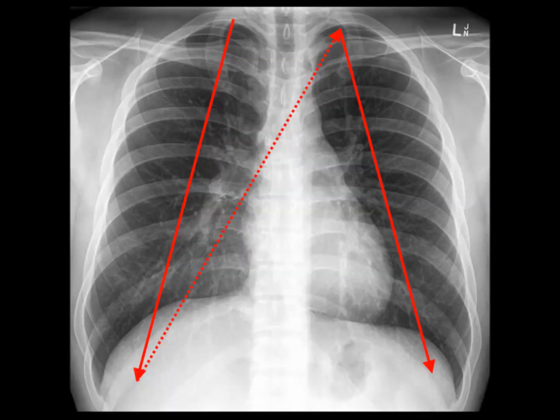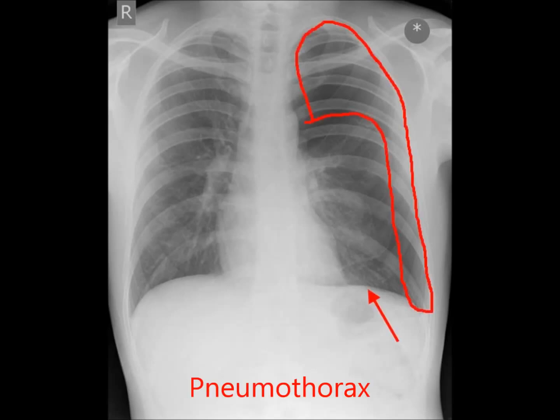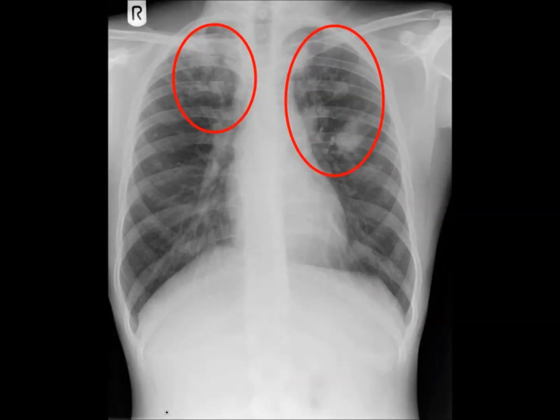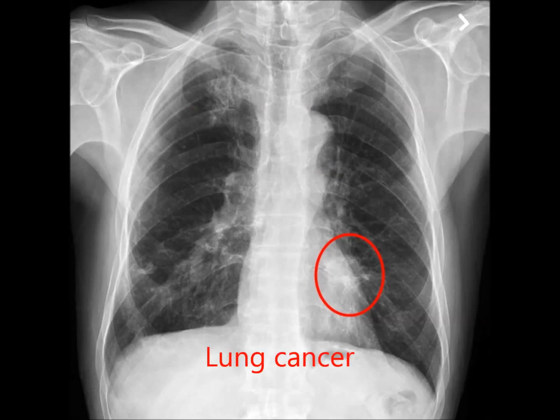Look carefully from the top at the apices to the bottom where the lung extends just below the diaphragm. Compare left to right. First, see if there are any areas where normal lung markings are absent, as this may indicate collapse or pneumothorax. This patient has a left-sided pneumothorax — I've outlined the area where the lung markings are absent. Also notice that the left hemidiaphragm is flattened compared to the right. Also look for any areas of abnormal shadowing, such as in this patient with tuberculosis, or any opaque masses, such as in this patient with lung cancer.